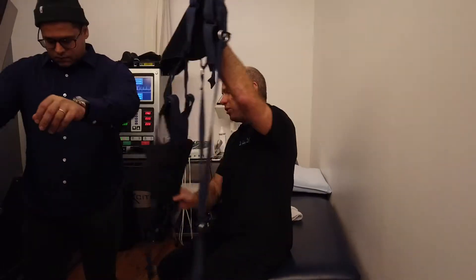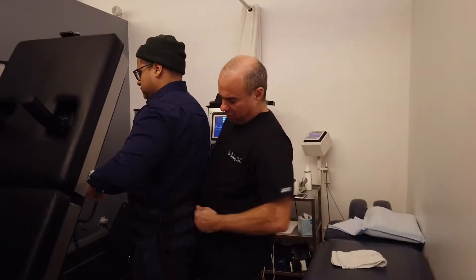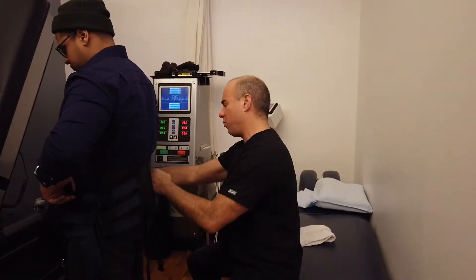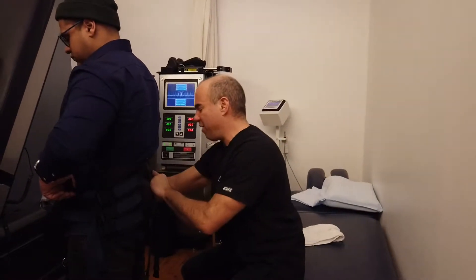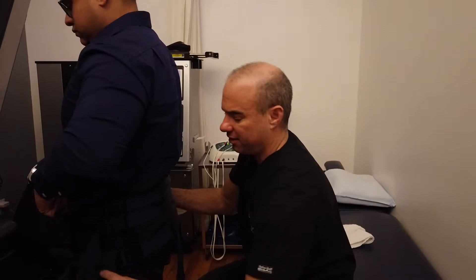Let's get them on the table. What we're doing is we're harnessing this pelvis harness. Most patients, once they're on the table, I have them bring their iPhone so they're watching one of their favorite programs. Some people just put on headphones and fall asleep — it's super comfortable, it doesn't hurt. It helps to unload and decompress the disc.